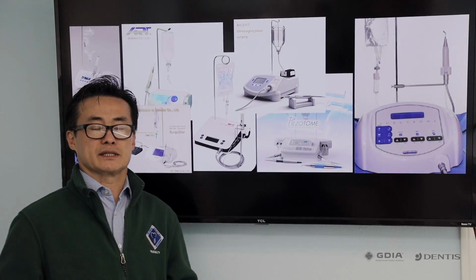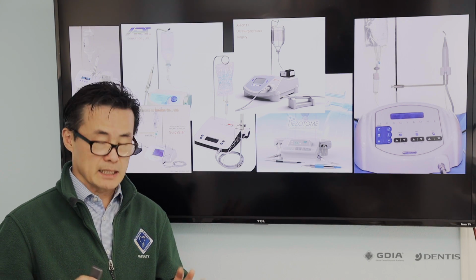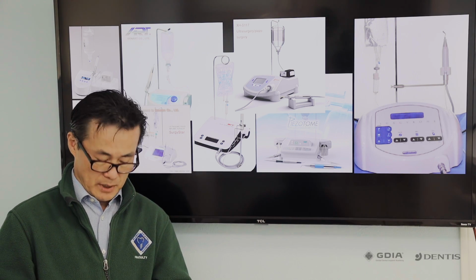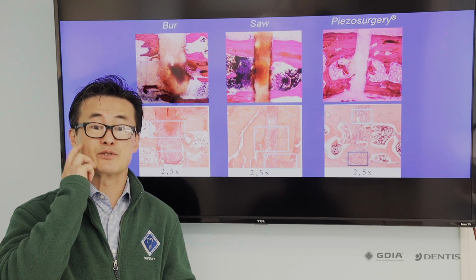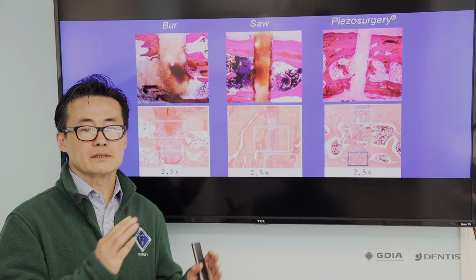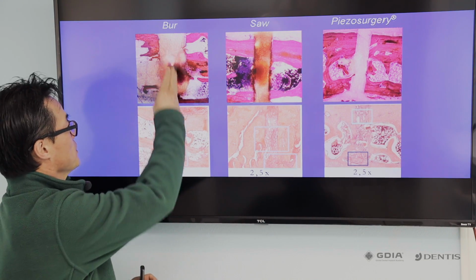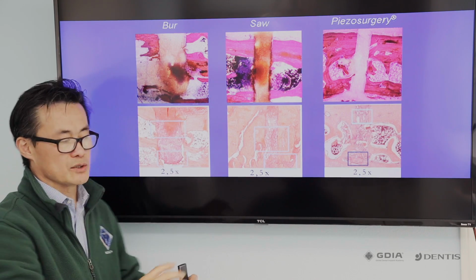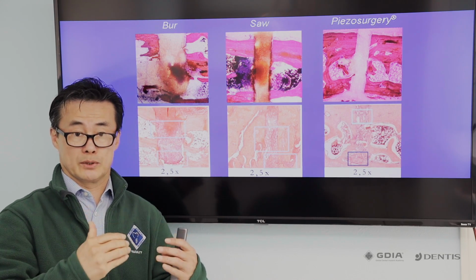There are many products like the piezoelectric bone surgery products out there. And just for the technicality, this is called piezoelectric bone surgery device. Now, piezo surgery, as you see in this slide, is a trademark name from the original manufacturer's Mectron. But this technology, you see in histology when a rotary burr cuts the bone, it shows acute inflammation, even some bone that is dead or burnt.